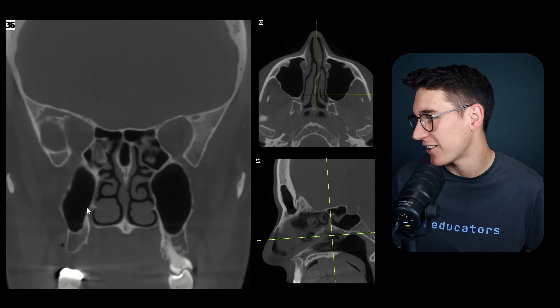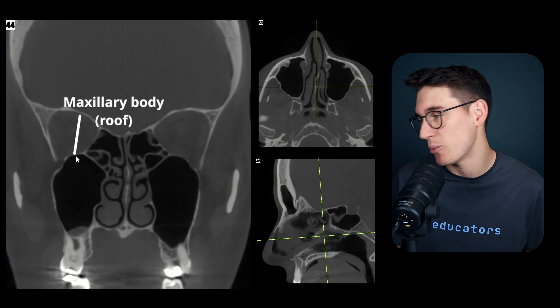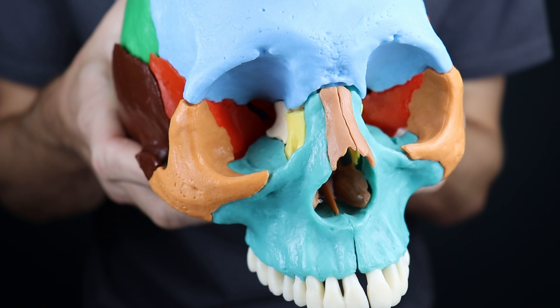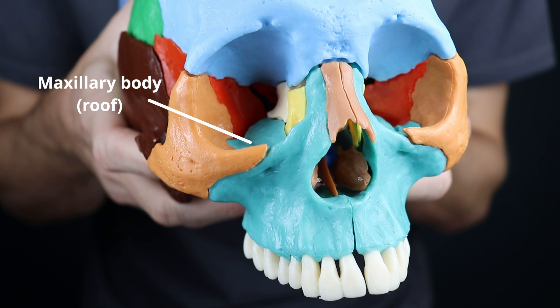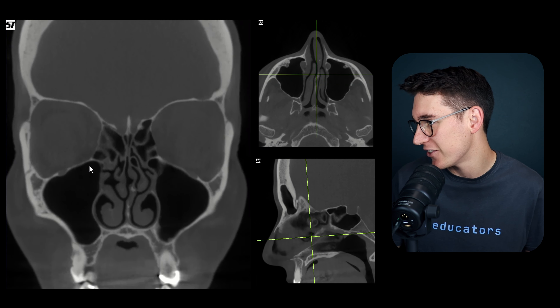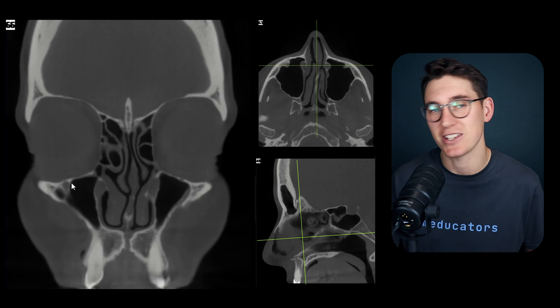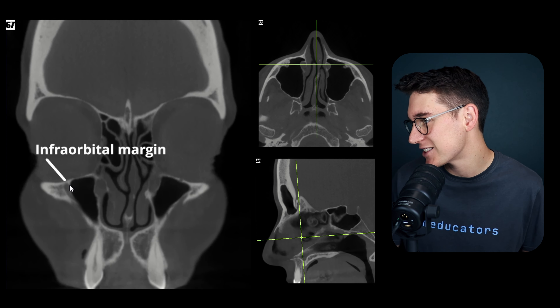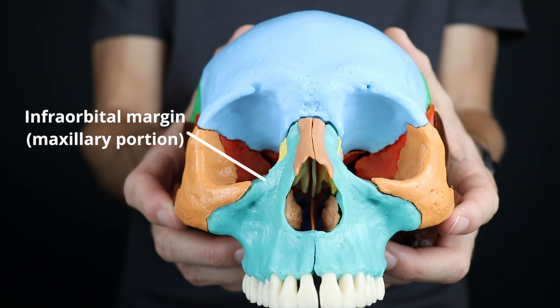Heading anteriorly again, the roof of the body of the maxilla - the roof of the maxillary sinuses - makes up the floor of the orbit. As we head anteriorly to the infraorbital margin, the maxilla makes up at least the medial half of that infraorbital margin.